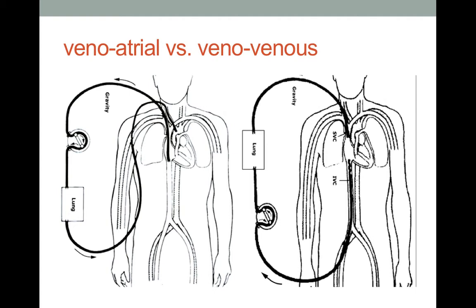With bypass, the whole goal is to divert the blood away from the heart and lungs so that you can provide a motionless, bloodless field so the surgeons can operate. But this is very temporary. You can't keep a patient on bypass for days. And that's what Dr. Bartlett and his colleagues set out to change.